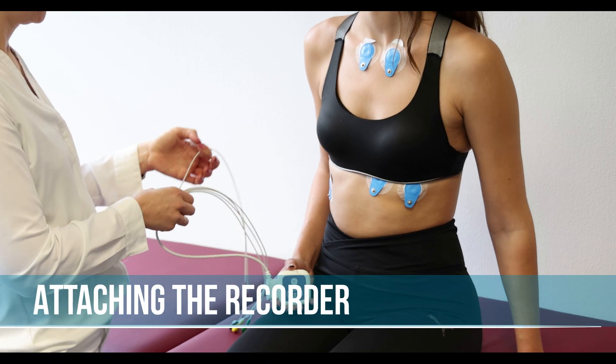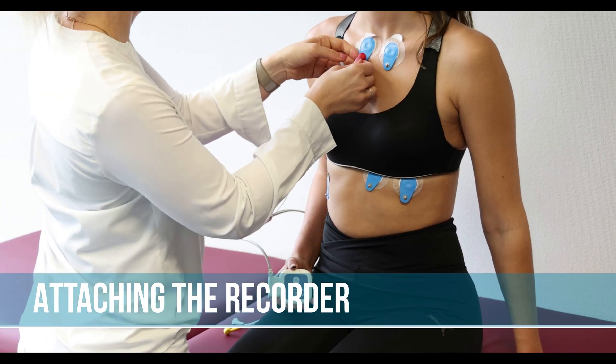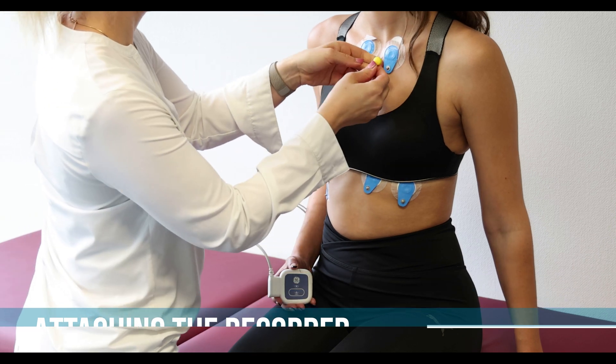While you are connecting the cable ends to the electrodes, avoid creating knots in the cables by taking a cable that starts from the connector.